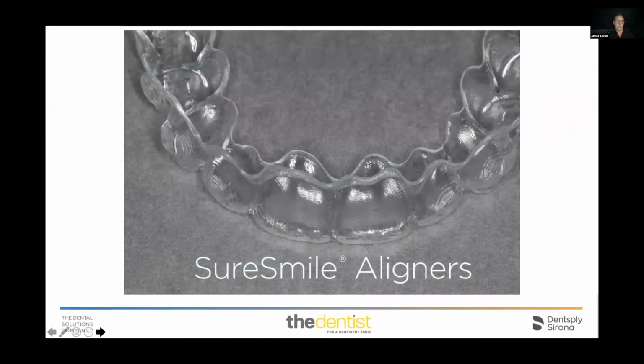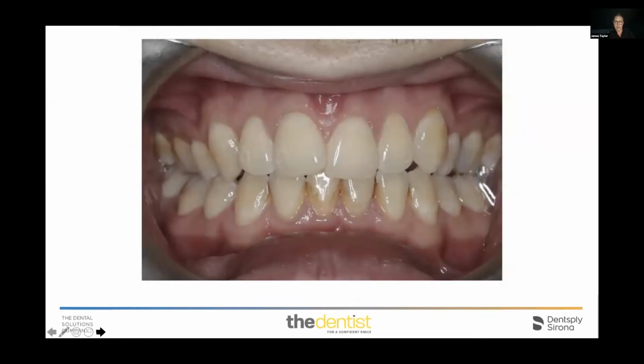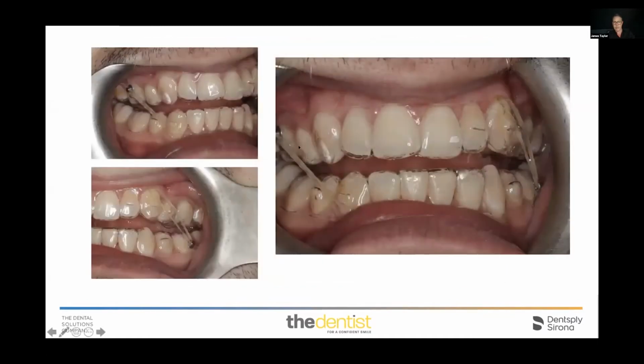The aligners are lovely, they're very transparent, they're very clear, they're beautifully finished on the edges, and they fit great. Again, I think I was mentioning, this is the case where we've got, just to show you, that his center lines are off, and I'm using asymmetric elastics. I'm using class 3 elastics on one side and class 2 elastics on the other, just to improve the center line essentially whilst wearing the aligners. So I will use elastics where possible, and they're beneficial. The system allows you to use them as you wish.